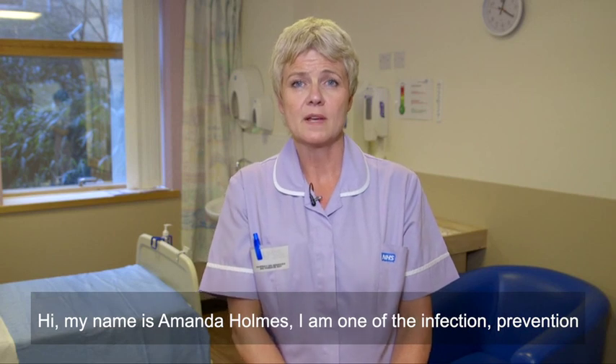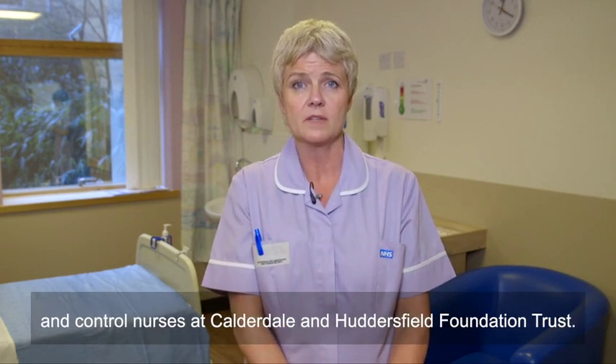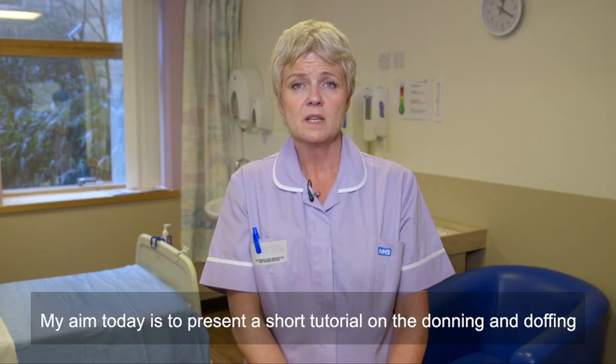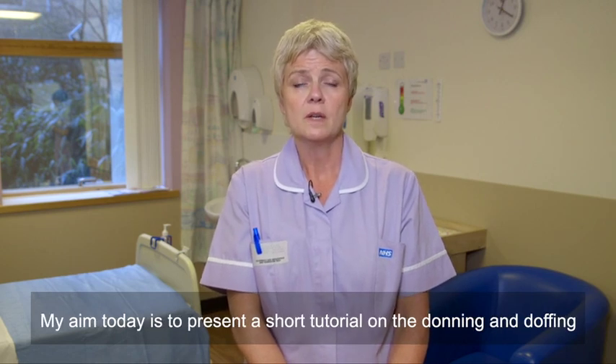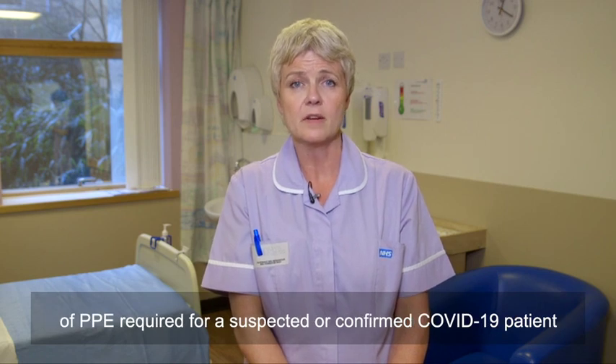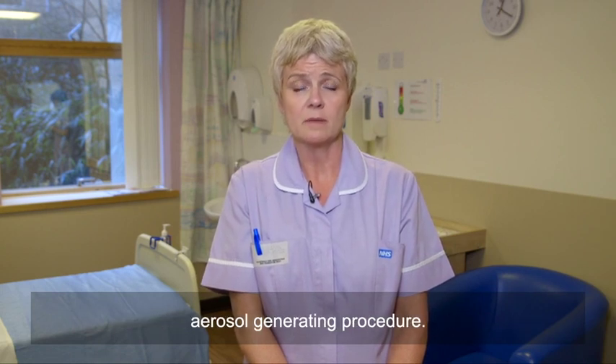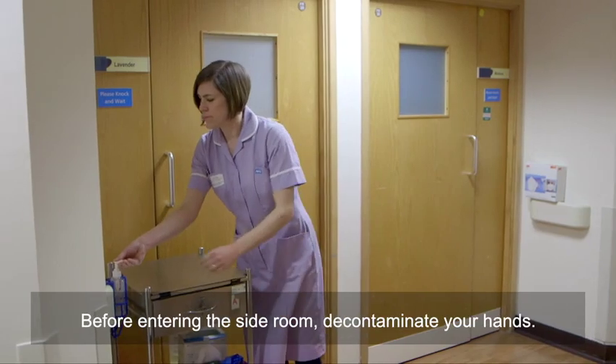Hi, my name is Amanda Holmes. I'm one of the Infection Prevention and Control Nurses at Calderdale and Huddersfield Foundation Trust. My aim today is to present a short tutorial on the donning and doffing of PPE required for a suspected or confirmed COVID-19 patient, and when you do not expect to be performing an aerosol generating procedure.